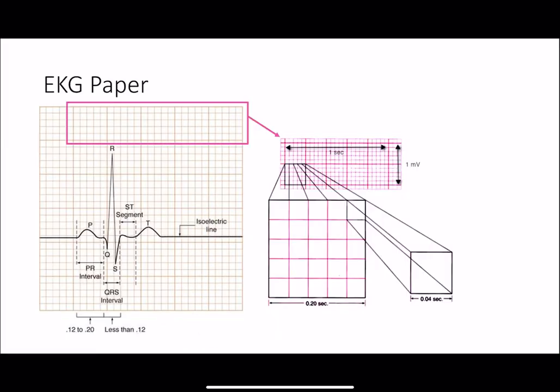So I'm going to give you a little bit of notes on the EKG paper. This one is a little obligatory. You can't give an EKG lecture without going through the details of the EKG paper. Although in our world, we most often are reading EKG on a monitor, so this matters less in real-time PT stuff, but this is great for EKG questions on board exams and stuff.